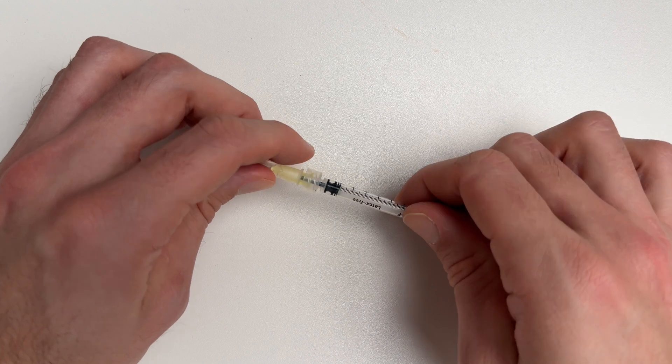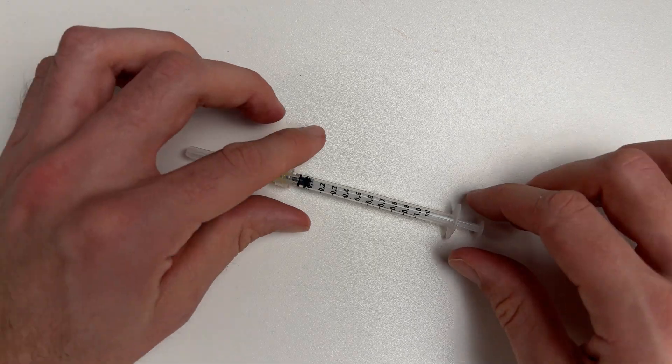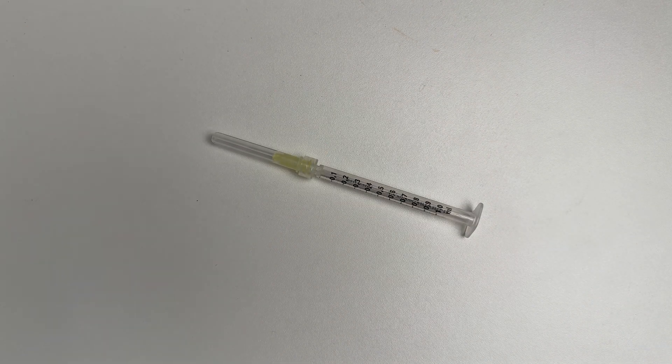This procedure is completely painless. Tell this to your patients beforehand in order to calm them down. Ask them to look at your ear and push forward and down with their head — this will keep their head and eye stable during the procedure. Once your patient is well positioned, you need to connect the needle and syringe without contaminating them. Then remove the plunger from the syringe. Now you're basically ready to go.